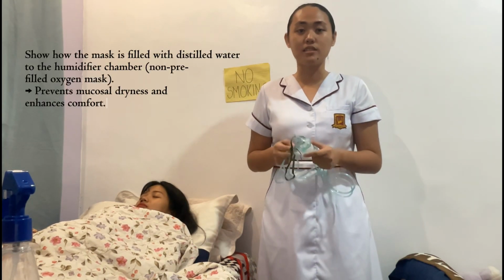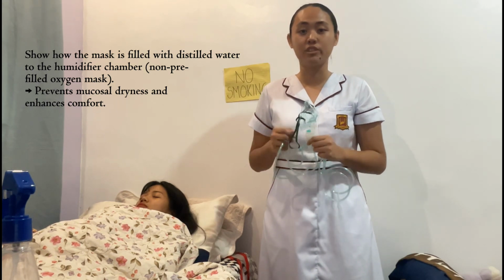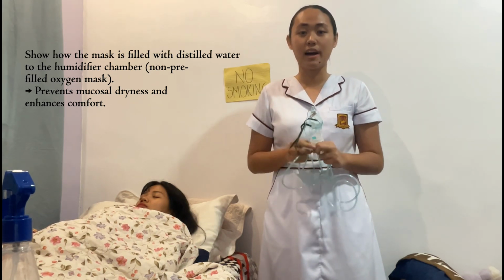Then show how the humidifier chamber is filled with distilled water for a non-pre-filled oxygen mask. So this is to prevent mucosal dryness and enhance comfort.